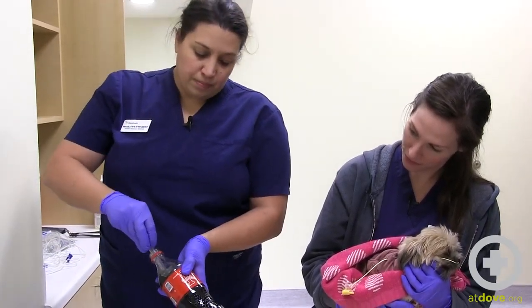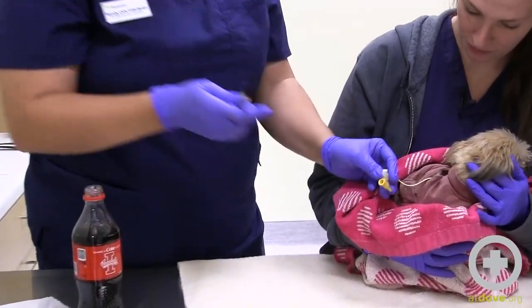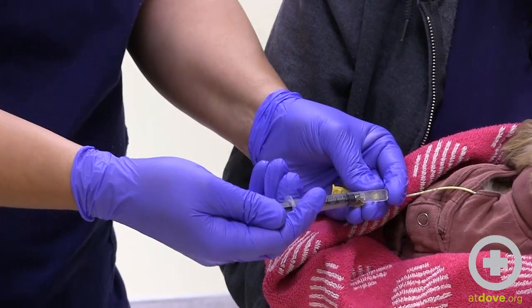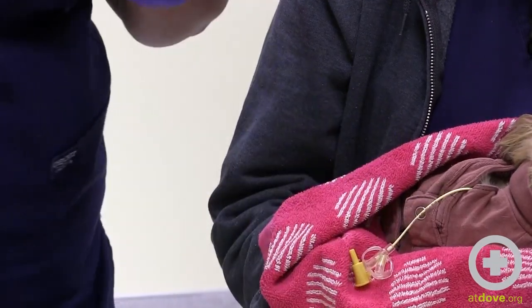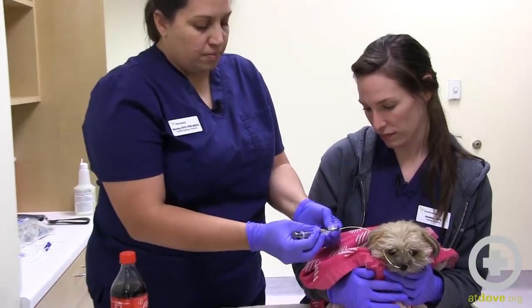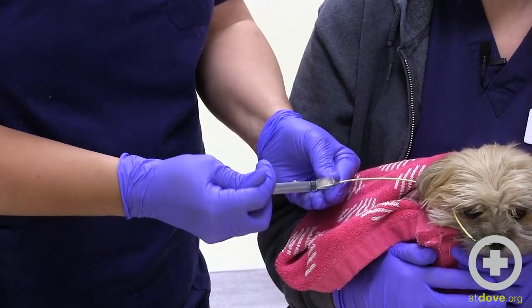There's no set amount, but for her I'm going to start with half a CC because she's so small. I'll put it on the end of the tube and pulse it in, getting a little more forceful. I was able to pulse that in. Now we're going to close this and wait about 10 minutes to see if the carbonation was effective in breaking up the clog. After waiting about 10 minutes, I'm coming back with warm tap water — warm water seems a little more likely to break up the clog. And you can see it's going pretty easily now — the Coke worked.